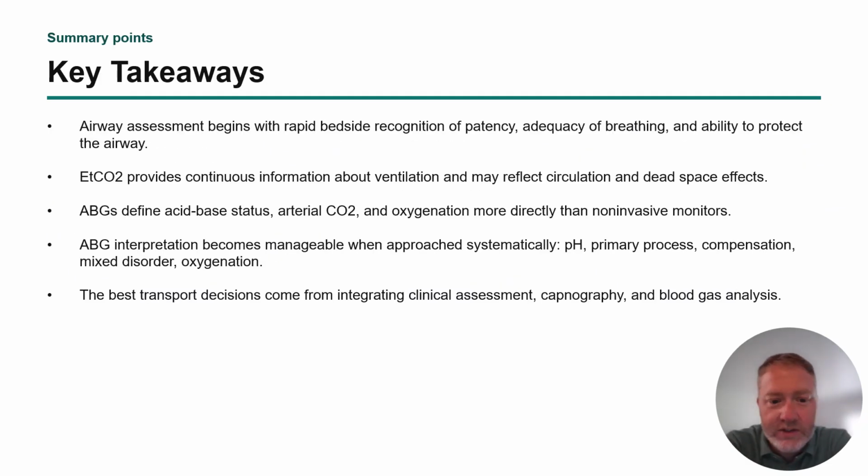Key takeaways, and I hate to just read it, but I'll just read it. Airway assessment begins with rapid bedside recognition of airway patency, adequacy of breathing, and the ability to protect the airway. End-tidal CO2 monitoring provides continuous information about ventilation and may reflect circulation and dead space effects based on the waveform. ABGs define the acid-base status, arterial CO2, PO2, oxygenation much more directly than non-invasive monitoring.